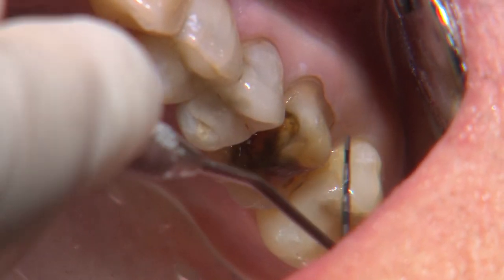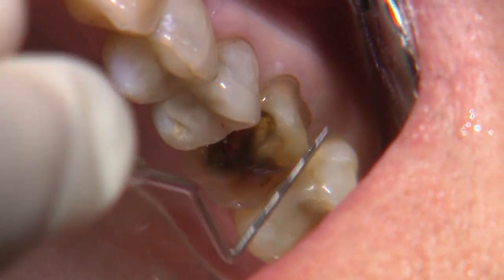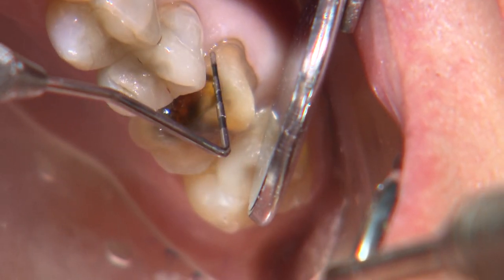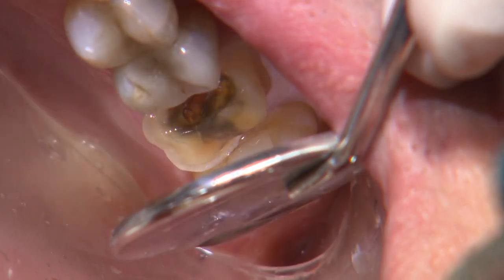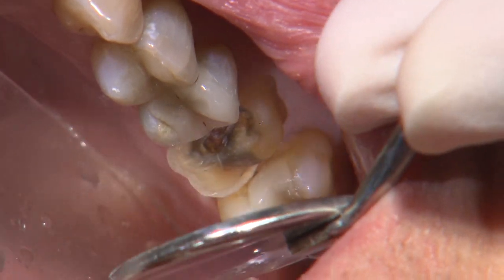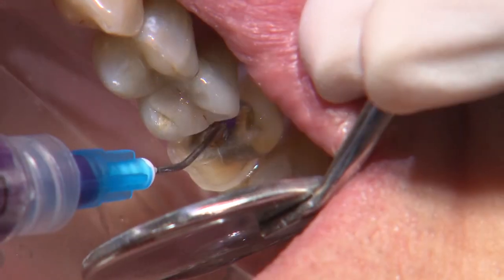I also like to run a perio probe along the margins to evaluate the reduction and smoothness. The probe provides great tactile feedback of these two aspects along this critical area of our preparation. On the mesial area, the translucent roof of the pulp chamber is visible.